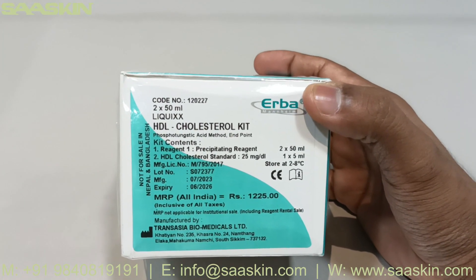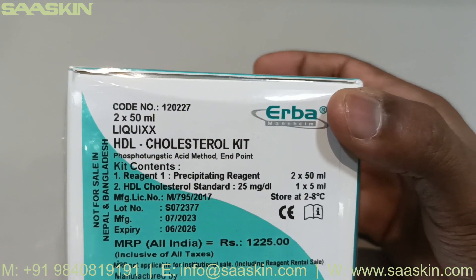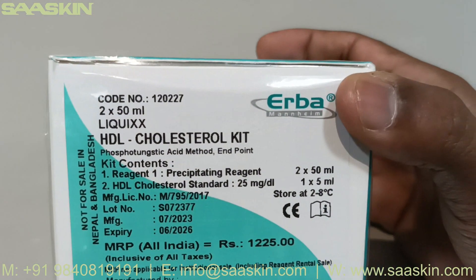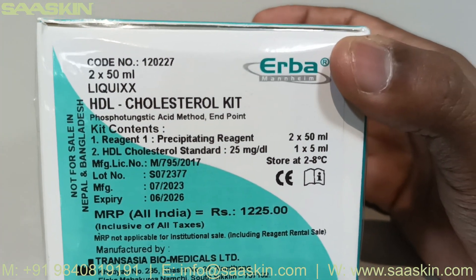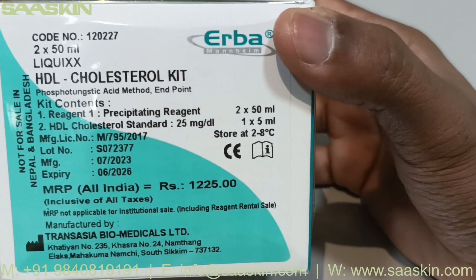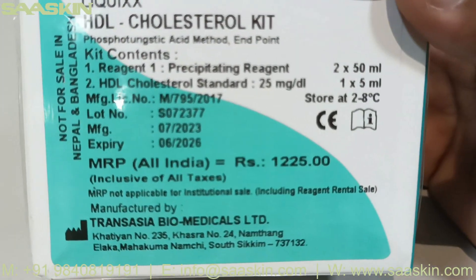This is the Liquixx HDL cholesterol kit. The catalogue number for it is 120227 and this kit contains a pack size of 2x50ml volume. This kit uses the phospho-tungstic acid method as the end point. The kit is CE certified, needs to be stored between 2 and 8 degrees Celsius, and has a standard expiry of 3 years.